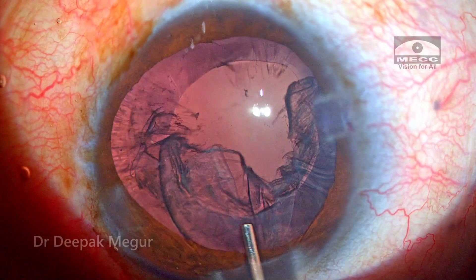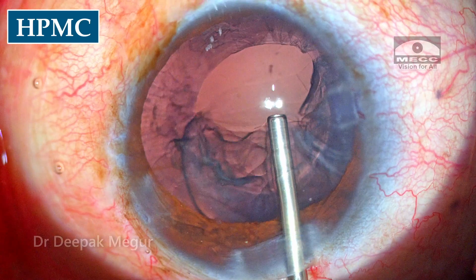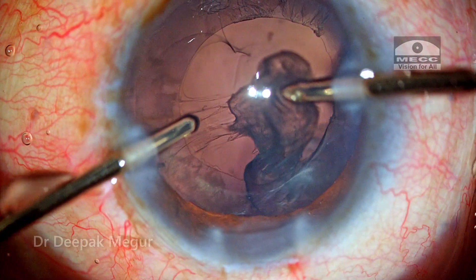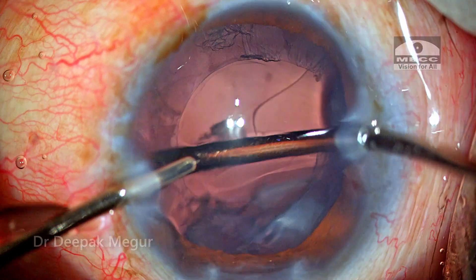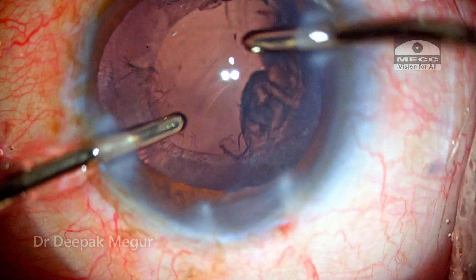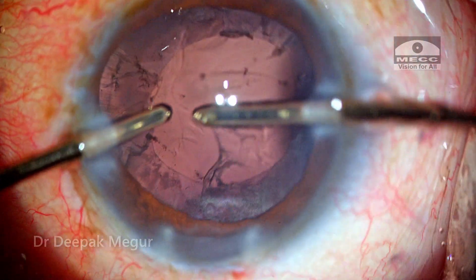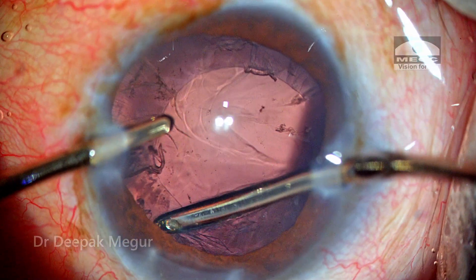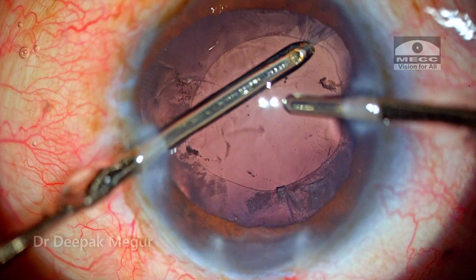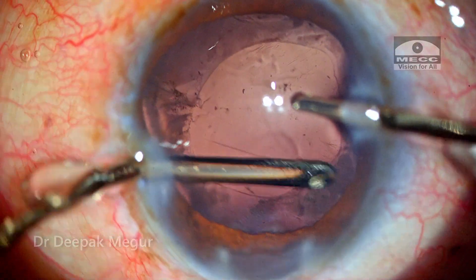The posterior capsule is gently blowed with BSS to clean off cortex sticking onto it. I'm inflating the bag with HPMC to ensure enough space, and I don't catch the anterior capsule while aspirating cortex — I want to aspirate without pulling or tugging at the anterior capsule, as it would induce zonular stress and worsen the pre-existing weakness. Slowly and carefully, keeping an eye on the aspiration port, the cortex is being peeled off. I'm always watching how the capsule bag is behaving and watching for any worsening of zonular weakness, but so far the bag seems to be holding on well.